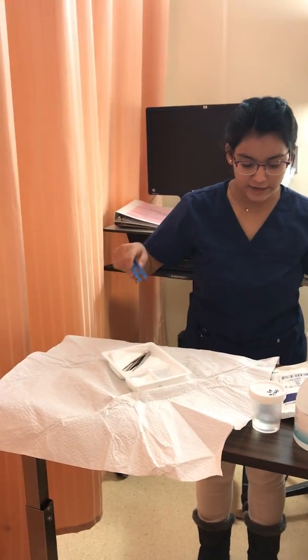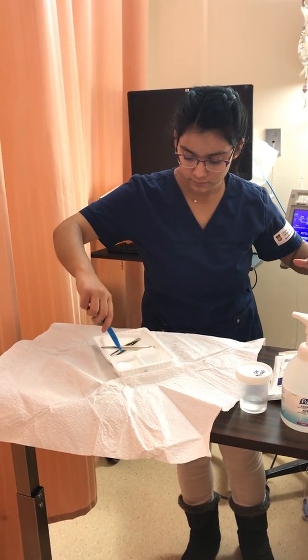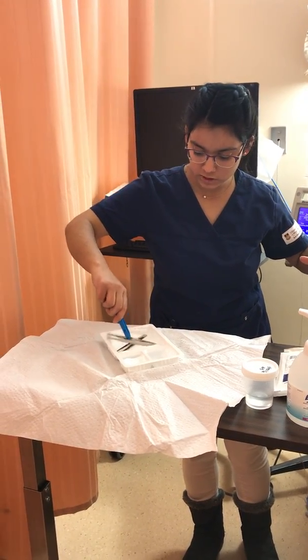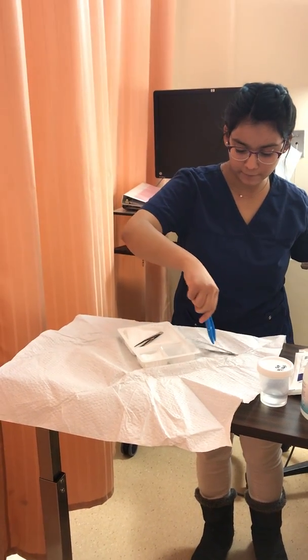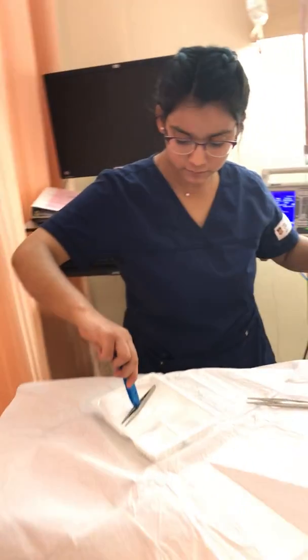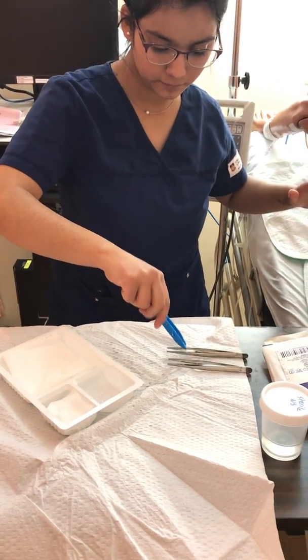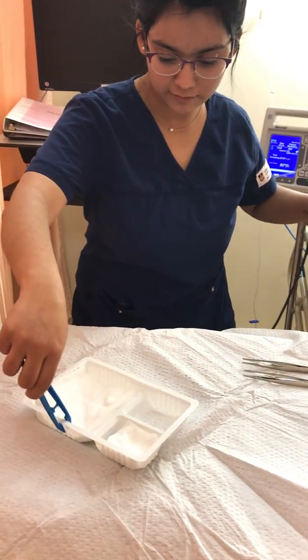Remaining. And now I'm just going to simply take my forceps out. Drain sponge. Make sure that I'm not too close, and then I'm just going to use tip to tip. So my drain sponge is drenched in normal saline. Make sure again that I'm not too close. Again, tip to tip. And I'm just going to move this down here so I have more space.